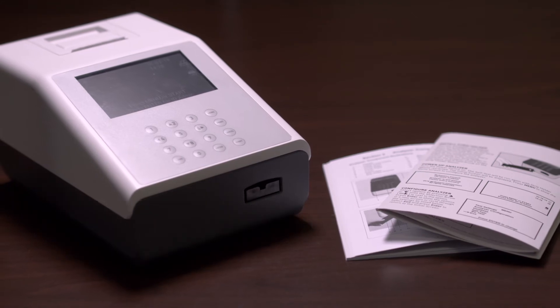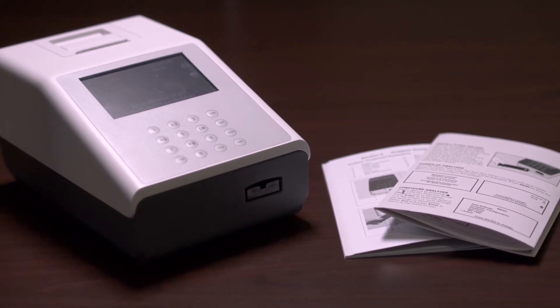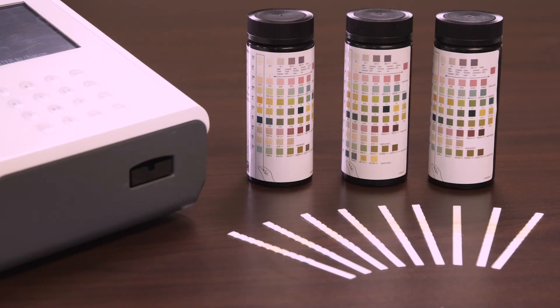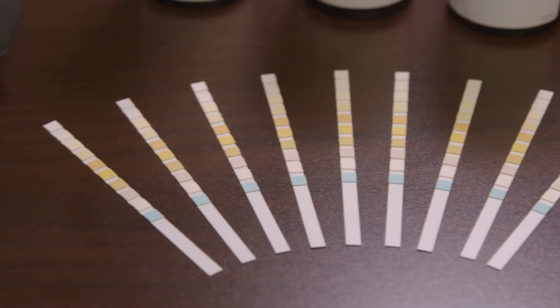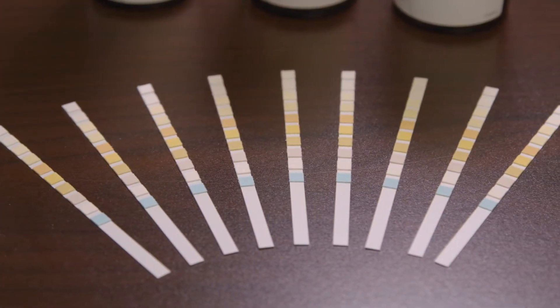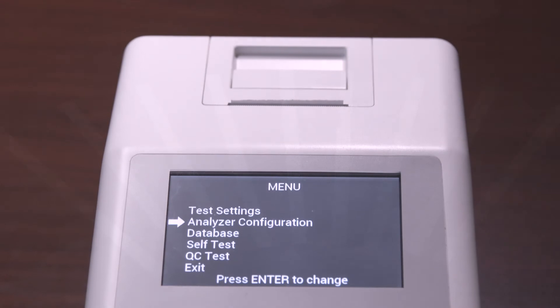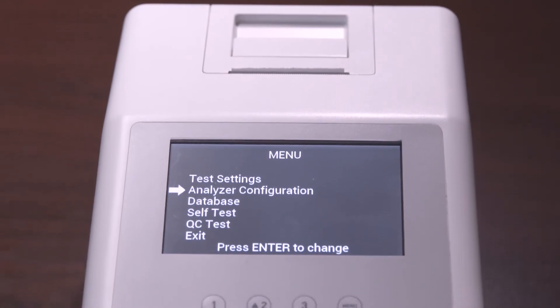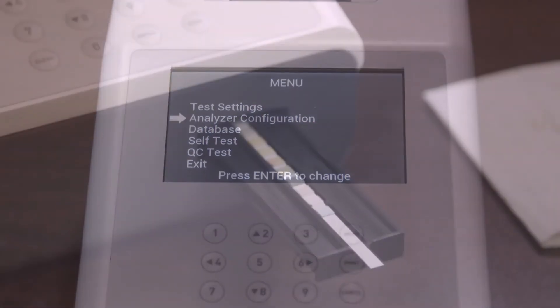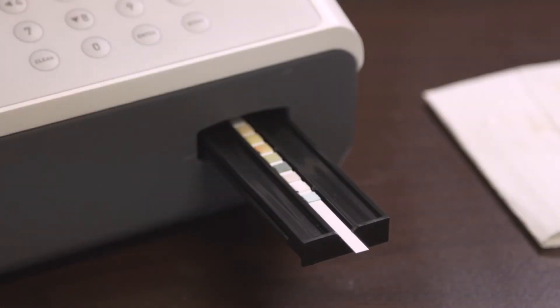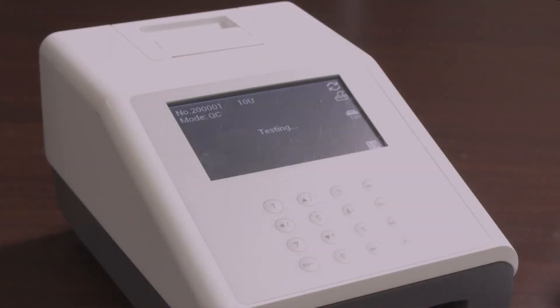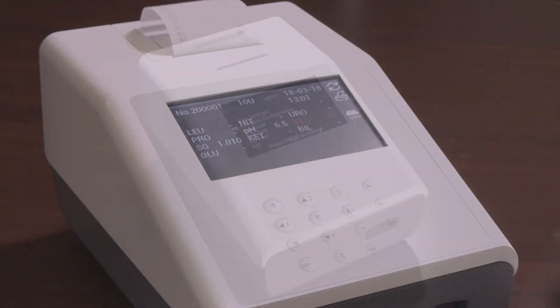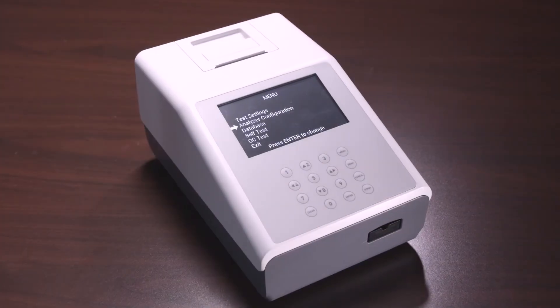The 120 urine analyzer is a manual reflectance photometer that analyzes the intensity and color of light reflected from the reagent areas of a urinalysis test strip. It is specifically designed for improved accuracy and efficiency. It can read up to 120 strips per hour. In this video, we will review the most commonly used features of the 120 urine analyzer.